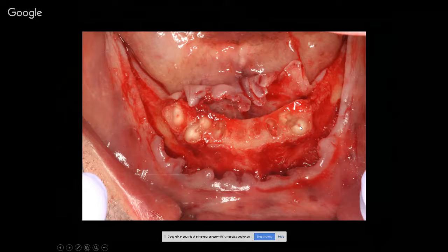So my thought process was, if I remove the teeth and the roots all at once, then I pretty much lose my orientation of where I need to put everything. But if I'm able to make my bone reduction guide and reduce the teeth and the bone all in one segment, then after I remove my guide, I will know if the guide was just as accurate as I did it on the digital model. And actually, I didn't see any issues.